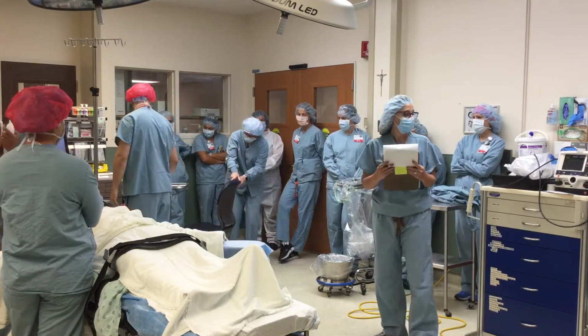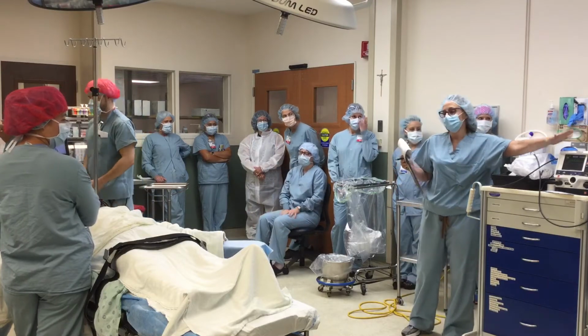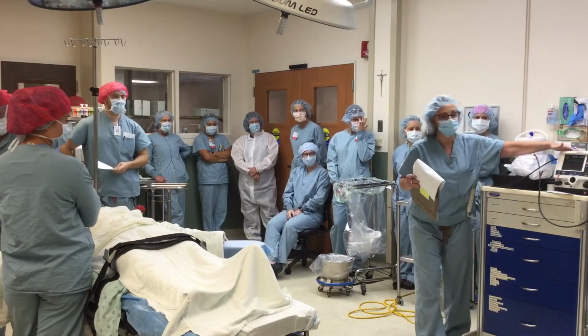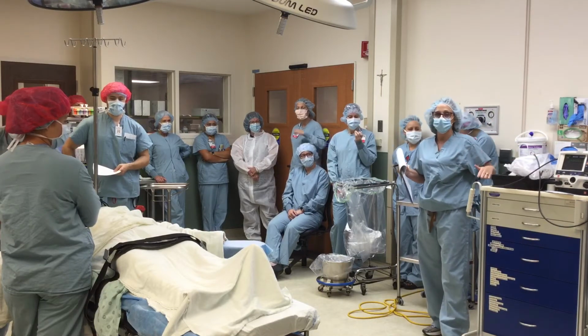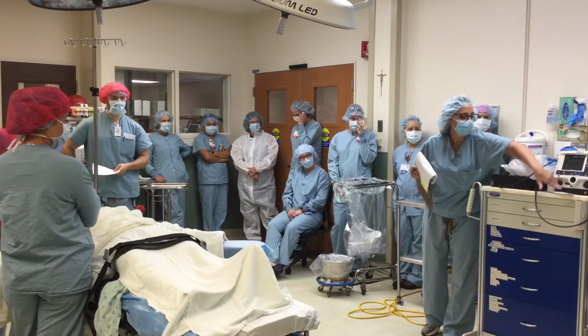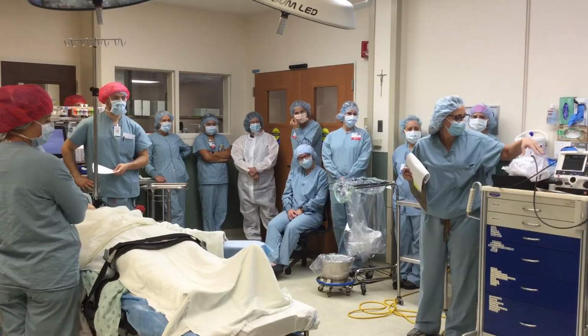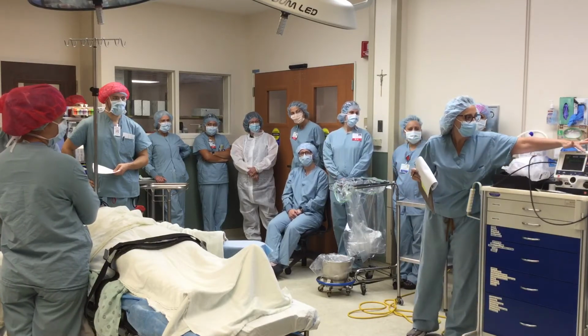And then the important person, I forgot who was supposed to be in this role, the crash cart. I have a simulator on here. Unfortunately, it won't work unless it's plugged in. The crash cart obviously isn't always in the room, but we're going to pretend we're bringing it in. We've got defibrillator pads that go on the patient and get hooked up to this. It's already going to be on.